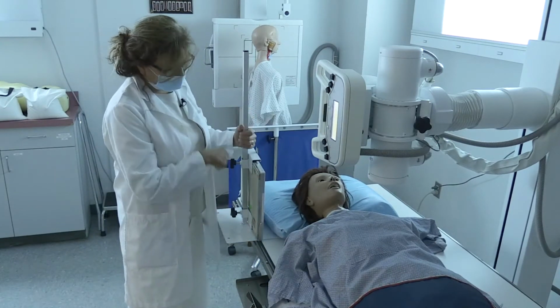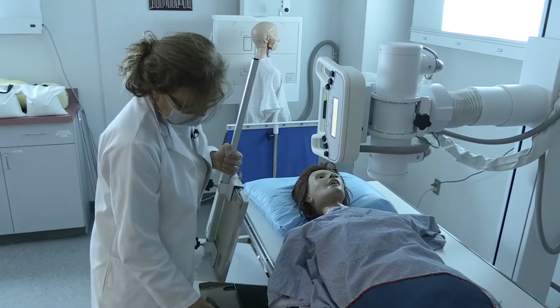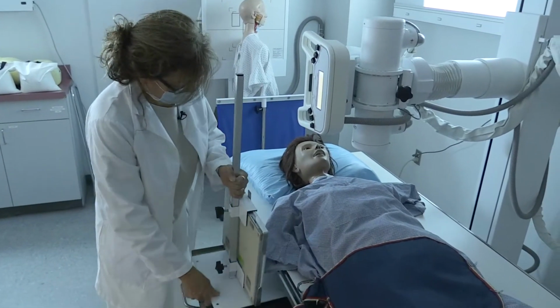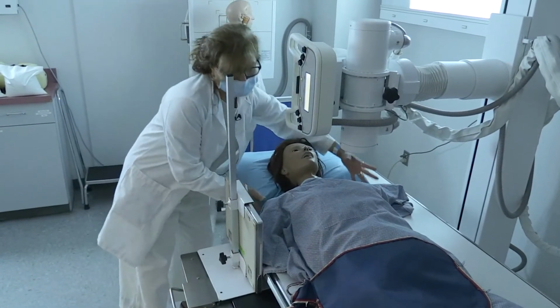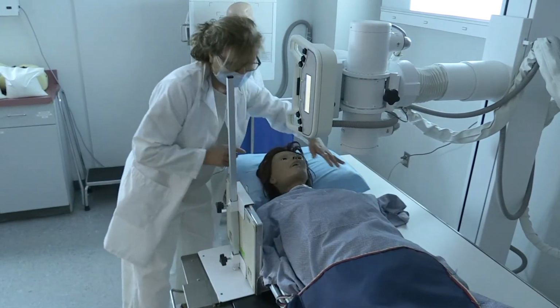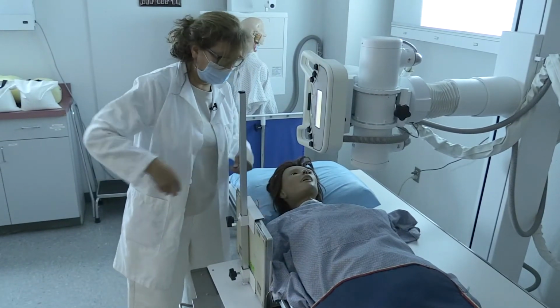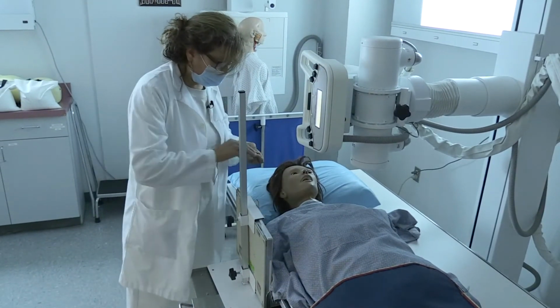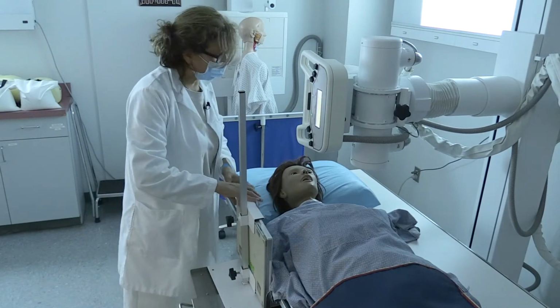So one thing I could do, if I don't have, for example, a stand or a cassette holder in a stand, I can probably use this as a stand. I want to make sure my patient is as close as possible to the image receptor. I'm going to place my right marker here.